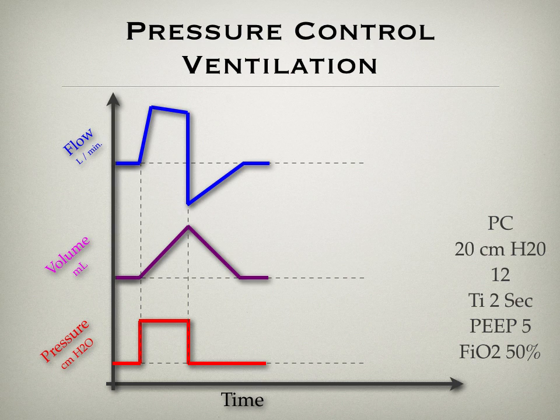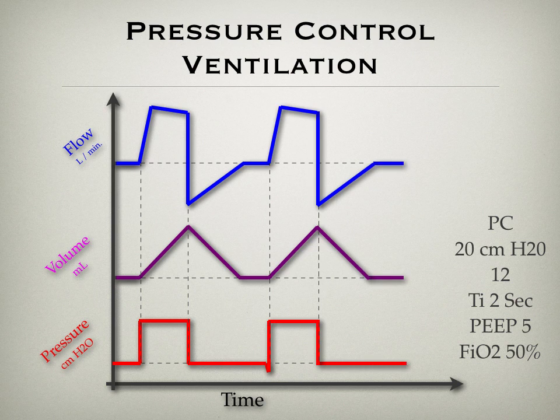And the same thing, because it's not pure pressure control, it's what we call assist pressure control. So if the patient triggers, he also gets the same pressure support for the same duration. And since we set pressures, we need to make sure we monitor tidal volume, because if the tidal volume changes due to compliance, we need to know about it to adjust our settings.